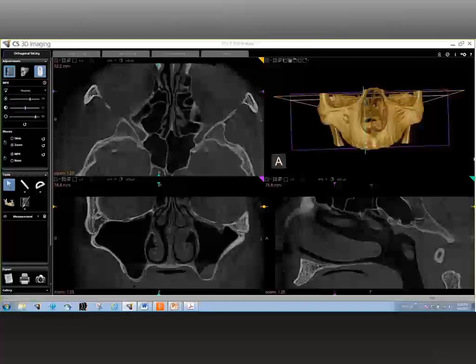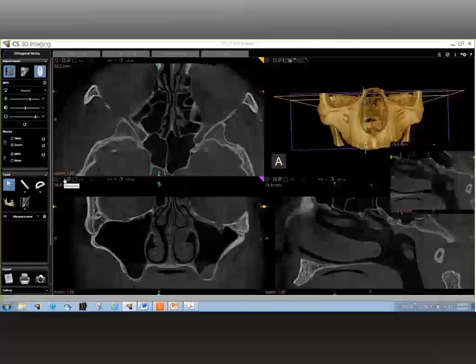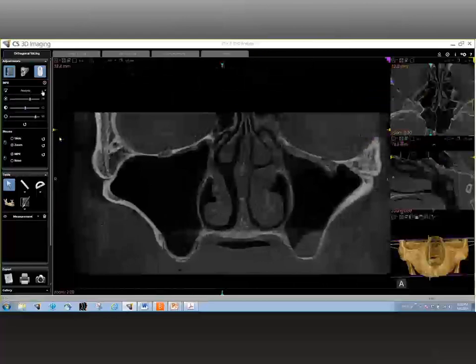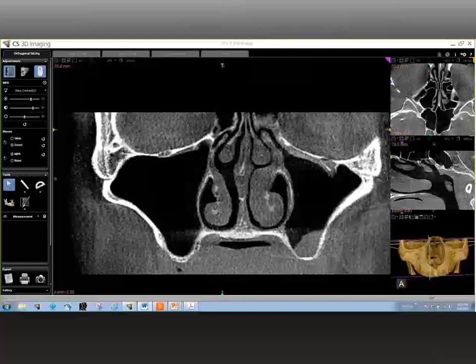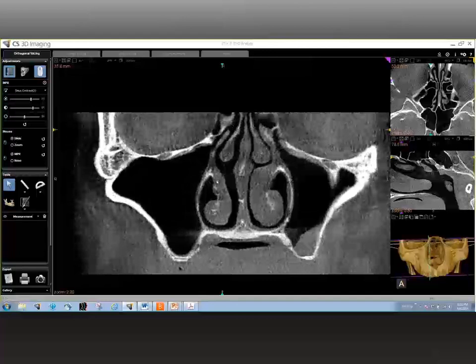What are the important anatomical landmarks of the maxillary sinus? There are not a whole lot of landmarks to evaluate, but the ones that are there are very important. Firstly, you see the floor of the sinus — the most inferior point. Then you have the lateral wall of the sinus, and then the roof of the sinus, which is the topmost extension and borders with the infraorbital rim or the lower border of the orbit. Then you have the medial wall of the sinus, which may not appear continuous because it is a very paper-thin wall and some parts may not be captured during scanning.